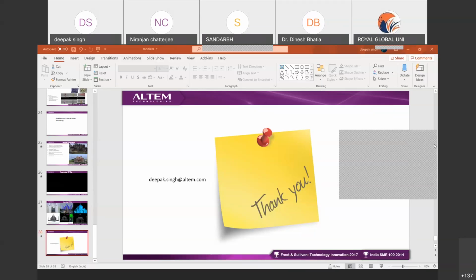And can we convert DICOM format to STL? We can change DICOM into STL, but not in this software. There is separate software called Mimics, and then Materialise. There are different software to change DICOM into STL. But yes, technically that can be done, just not in the scanning software.